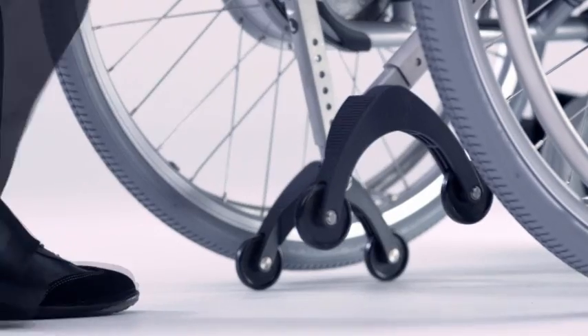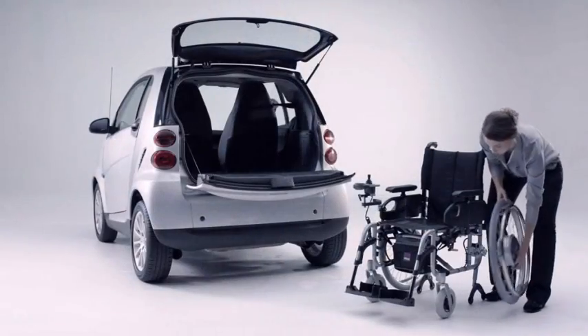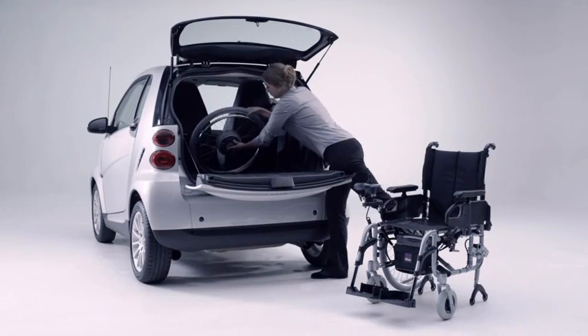The anti-tippers even have two functions. They prevent tipping and also make it easier for you to remove the wheels.